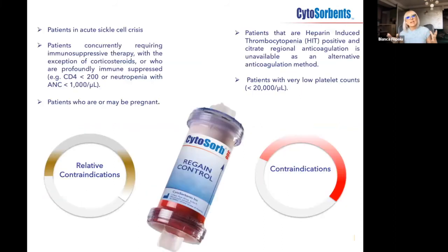So as with any kind of therapy, Cytosorb has some contraindications. Some of them are relative ones. The others are total contraindications. But let's see when we have to think twice before starting Cytosorb treatment.